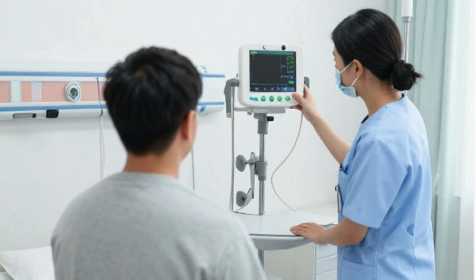The screen shows numerical values, waveforms, and trend graphs. For example, heart rate may be displayed as a number, while the ECG signal is shown as a waveform. Trend graphs allow clinicians to observe changes in vital signs over time, which can be more informative than a single measurement. One of the most important features of patient monitoring systems is the alarm system.